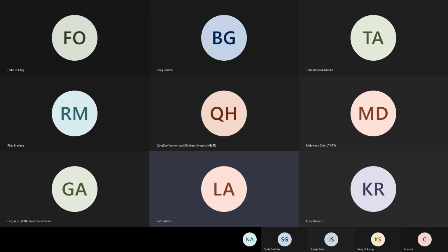If there is any doubt, sometimes that area is very shallow, so you can either put a very shallow patch, or, as I was saying before, you can use a modified single patch technique. But if there is space, just put your patch in a way that the area is kept of a good size. Pass a right angle dilator, just to have a look at what you're dealing with.